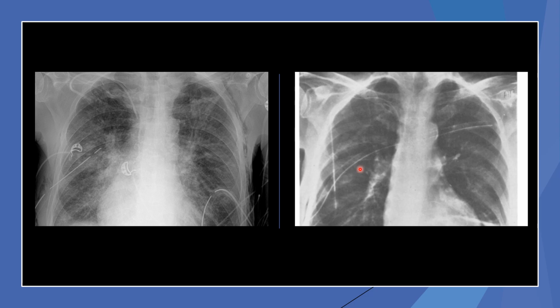And again, the only way to confirm the chest tube placement is by getting an immediate chest x-ray following chest tube placement to verify positioning of that, just like you would with any other kind of invasive line.